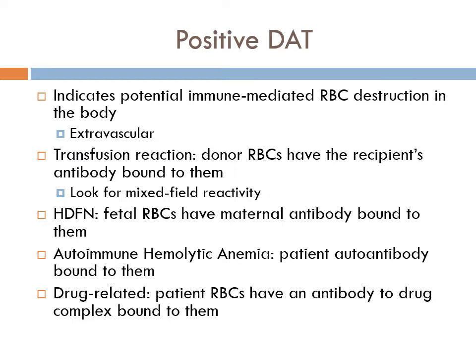For hemolytic disease of the fetus and newborn, fetal RBCs have maternal antibody bound to them. For autoimmune hemolytic anemia, the patient autoantibody is bound to the red cells. And for drug-related, patient RBCs have an antibody to a drug complex bound to them. Some drugs give you a positive DAT in the presence of the drug. Some drugs will cause positive DATs.